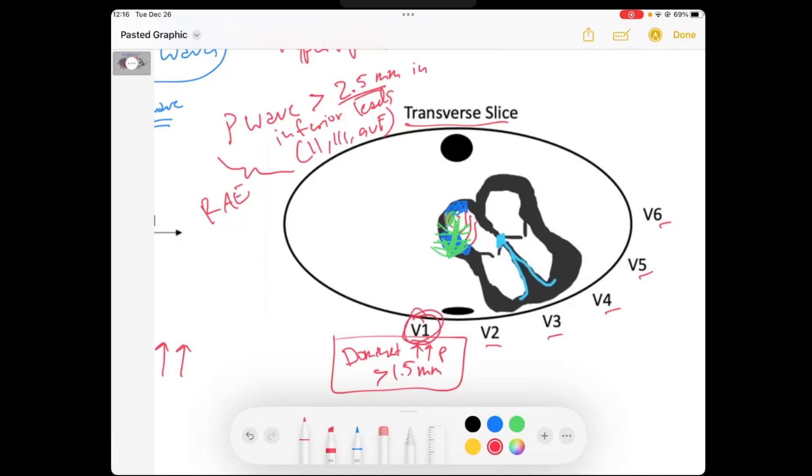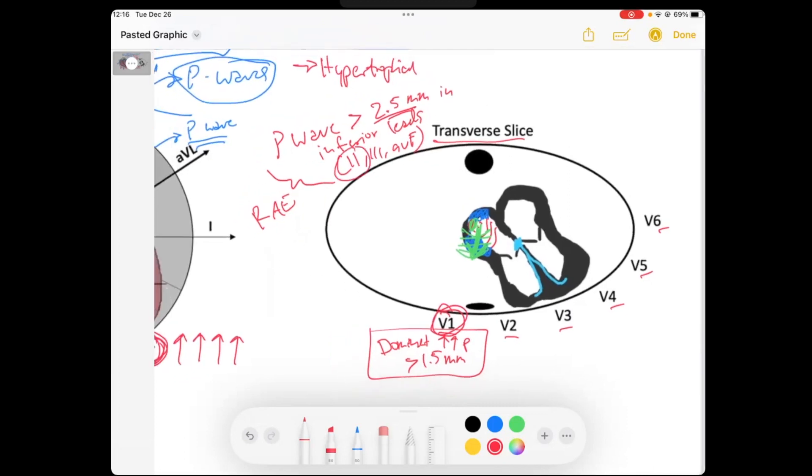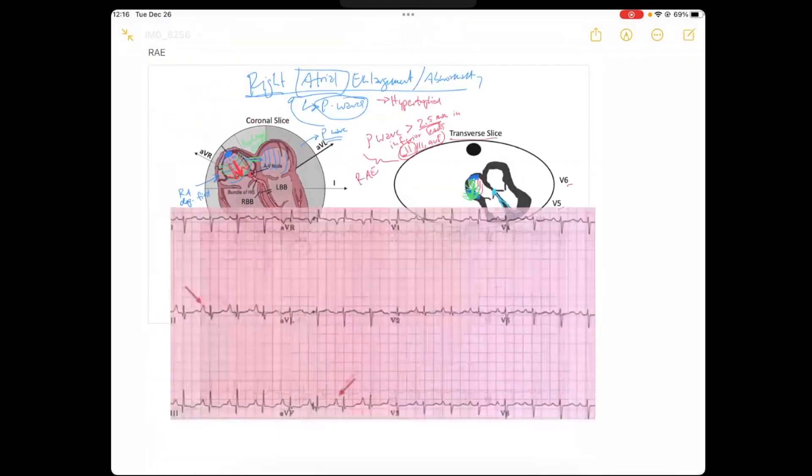So we can look at V1, and we can look at lead 2, 3, or AVF for very positive deflections on really the initial part of our P-wave to see right atrial enlargement. So let's take a look at an EKG.